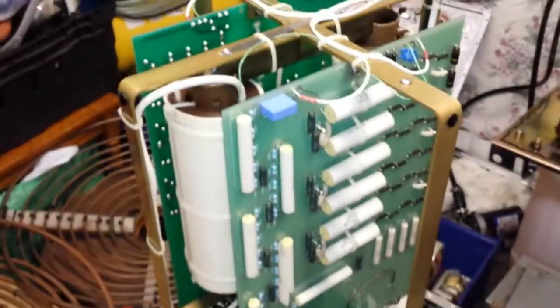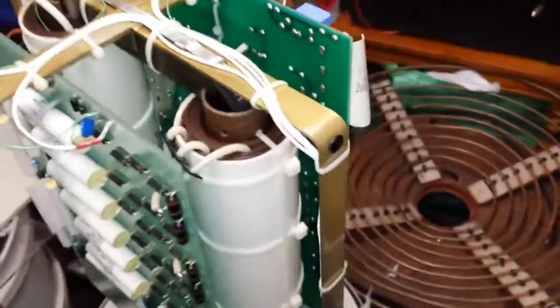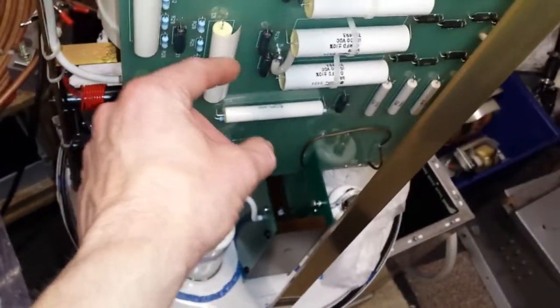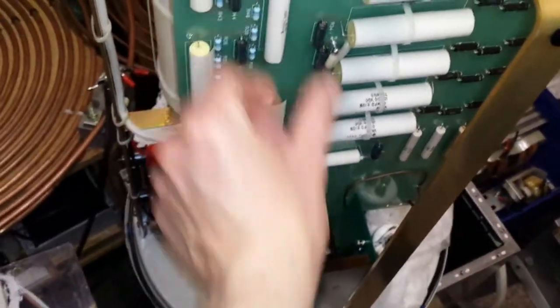So this one's open, the tub, and I've still got a lot of bloody oil inside there. You can just about see it reflecting there, and this is what is out of it. Isn't that just insane? Look at the size of that iron core. That is seriously some awesomeness. And there's caps on each side. Look at these rolls, these are the outer labels that have basically come loose a little bit from the oil. It's attacked the adhesive.